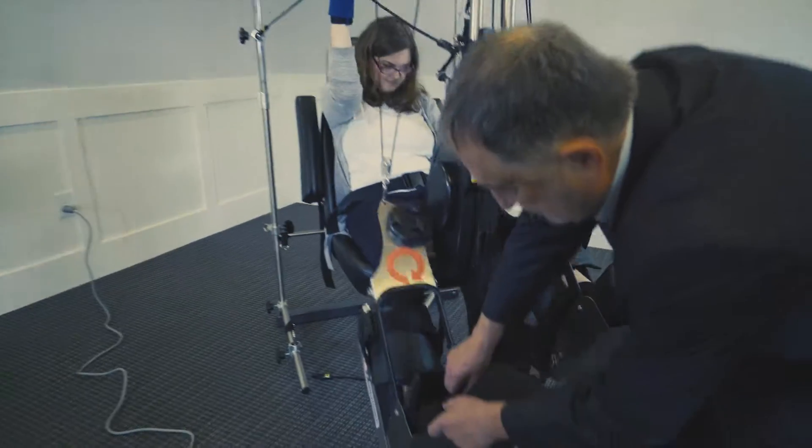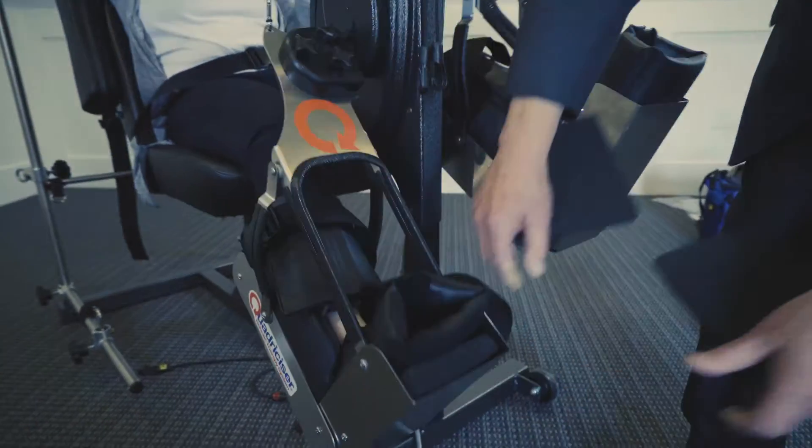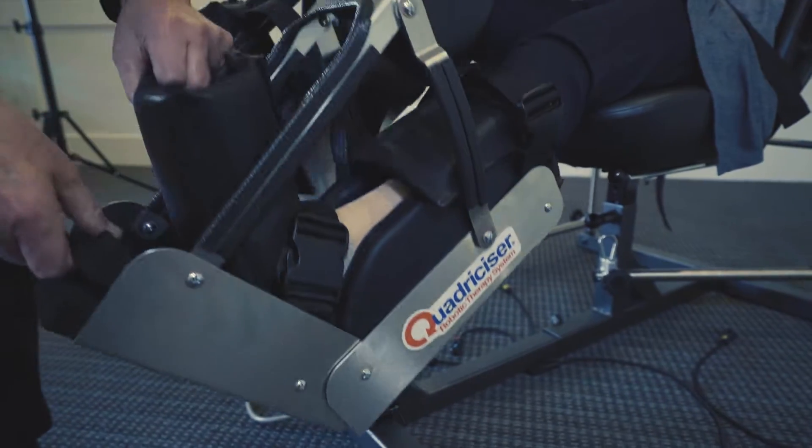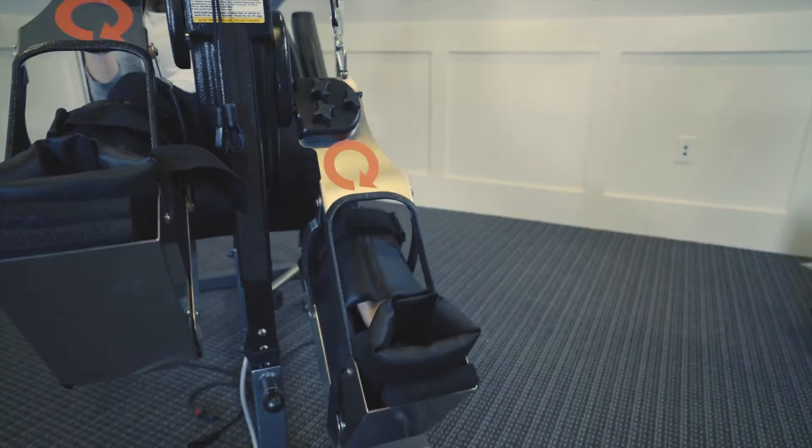This creates more dorsal flexion. And you don't have to stop the machine to make all of these different adjustments — do it little by little. That way she'll be able to pick that foot up.